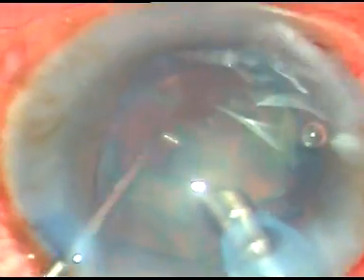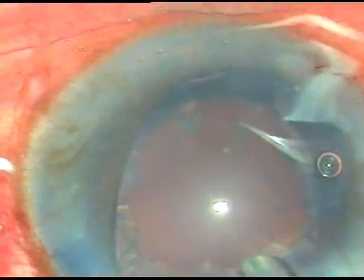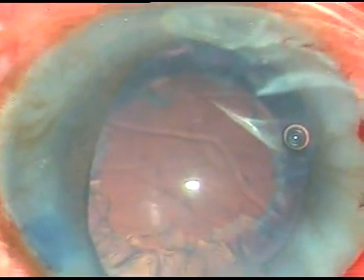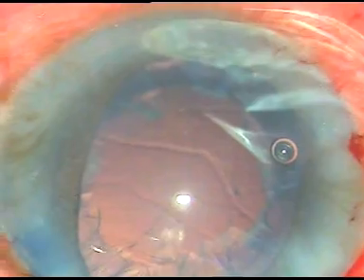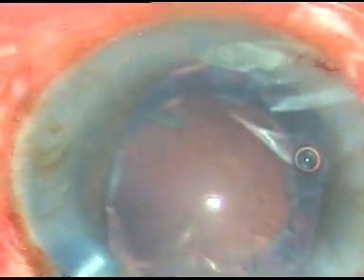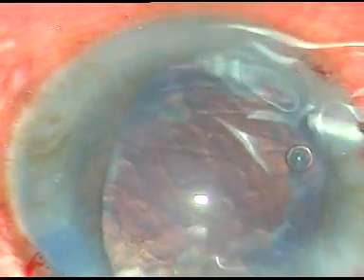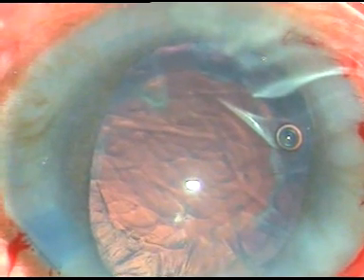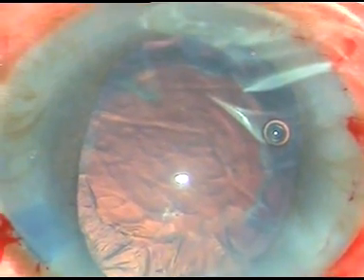The lens matter is emulsified and it's taken out. This is the last bit. That's it. The nucleus, that means the lens has been removed, the clear lens. Now I inject viscoelastic substance, little bit from this side port and some more from the other side port. And now I take 23 gauge Simcoe cannula to remove the cortical matter.